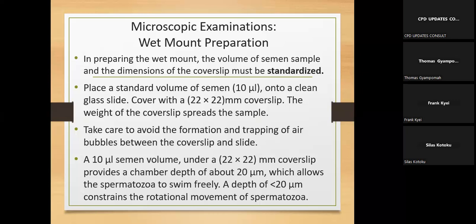That calculation will give you 0.02. I mean, it's 0.0206 something, but all you need is at least two decimal points, which is 0.02. The unit there is going to be millimeters, and I've explained why. It is millimeters because the numerator is 10 microliters, and 10 microliters can be converted to 10 cubic millimeters, because this is volume. So its conversion should be millimeter cubed.